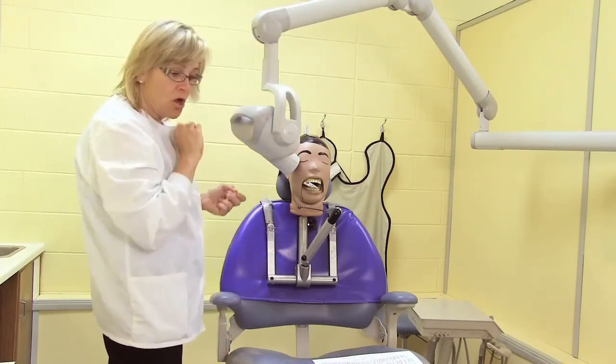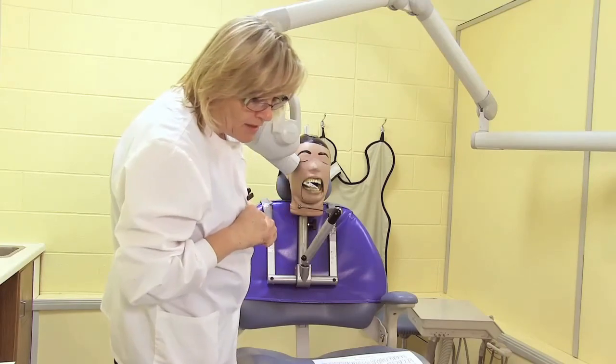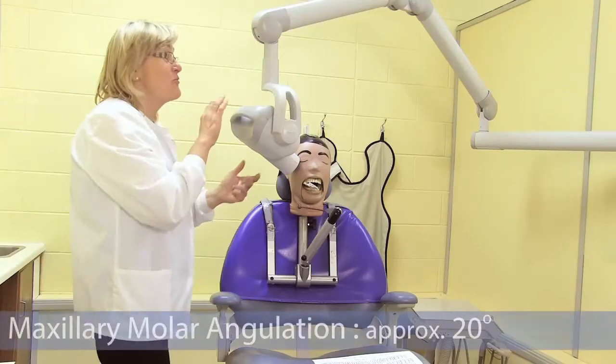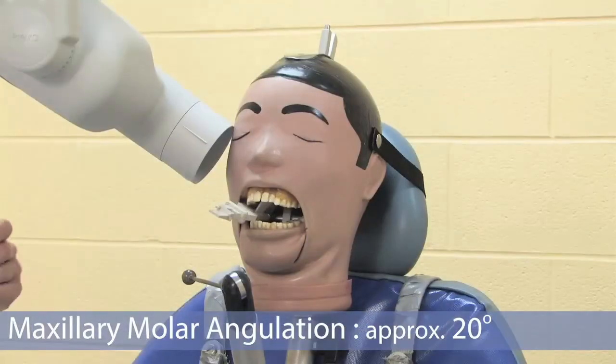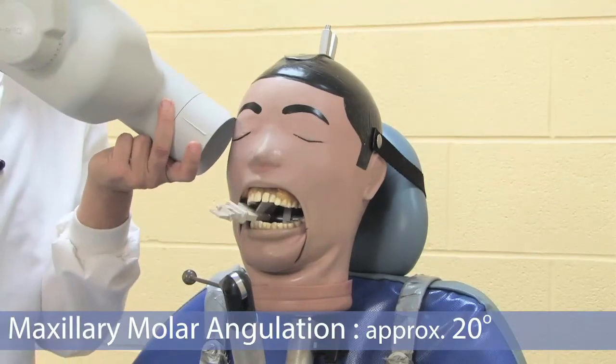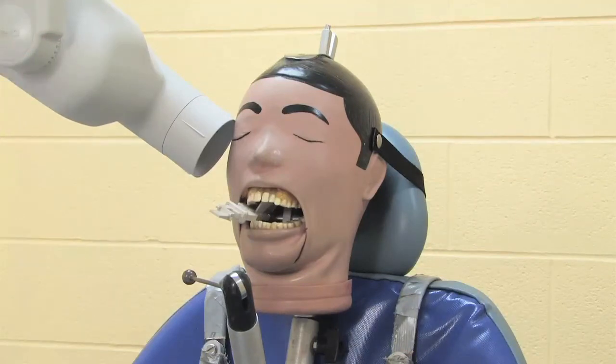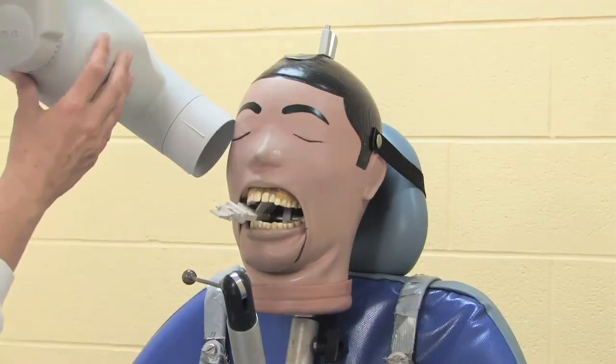So again, we know it should actually be, sorry, I read it wrong, it should actually be at plus 20 degrees, so that's a mistake. I was reading the other line down. So it should be at plus 20. But in this case, we know what's going to happen. We have to increase the vertical angulation because of the shallow palate.